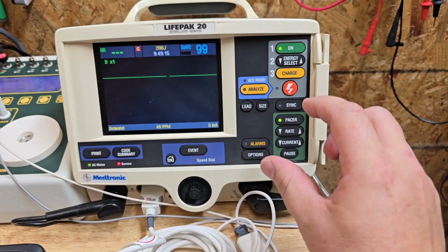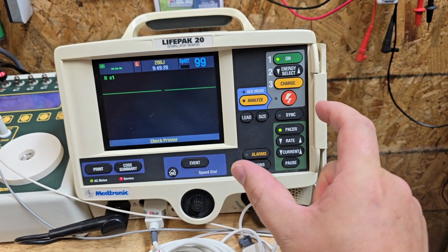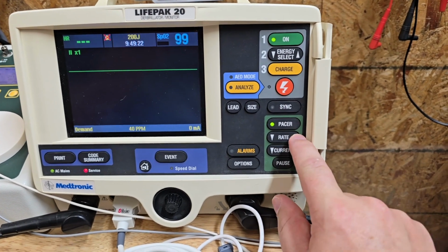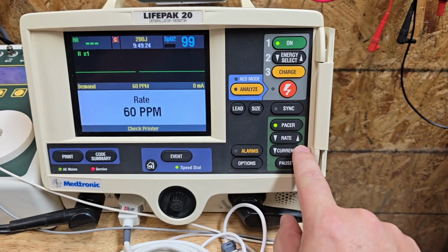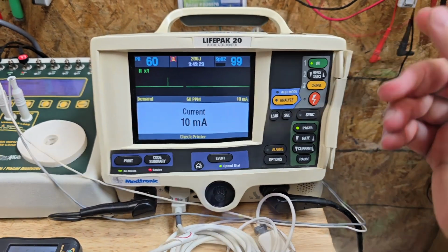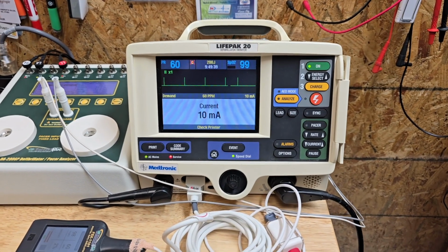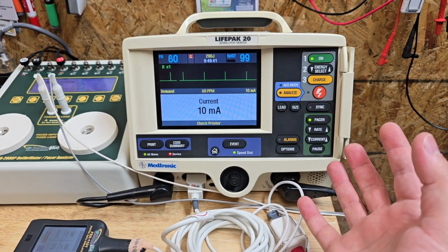So here we have a segment of a defibrillator and we have to test it, and it's under very strict tolerances. Let's go ahead and set this guy to 60. We're going to set the current to 10. You can hear it clickety clack right there. Now there's two types of pulses that are going to be given by any defibrillator: synchronous and asynchronous.